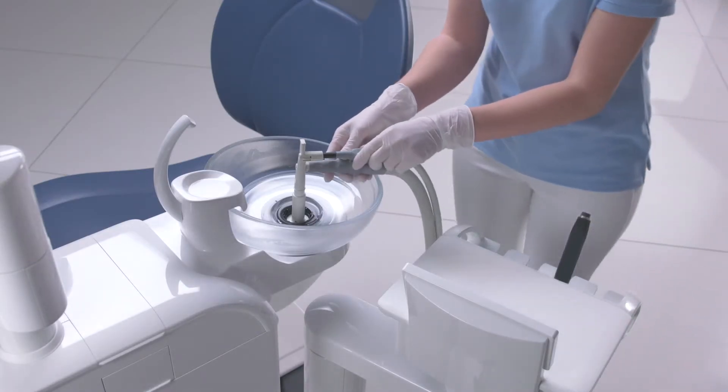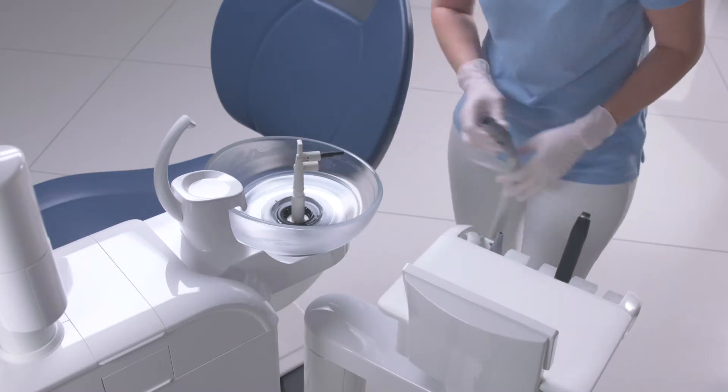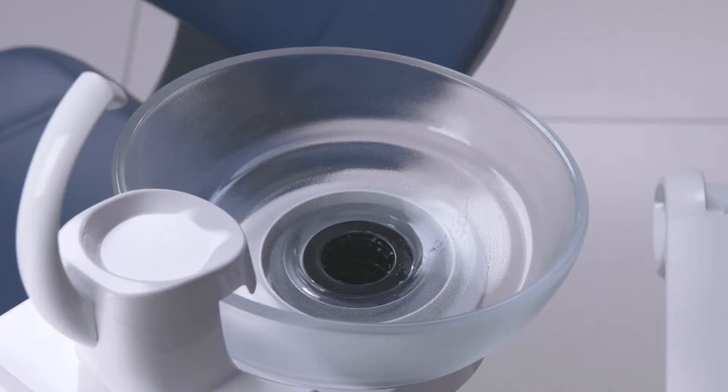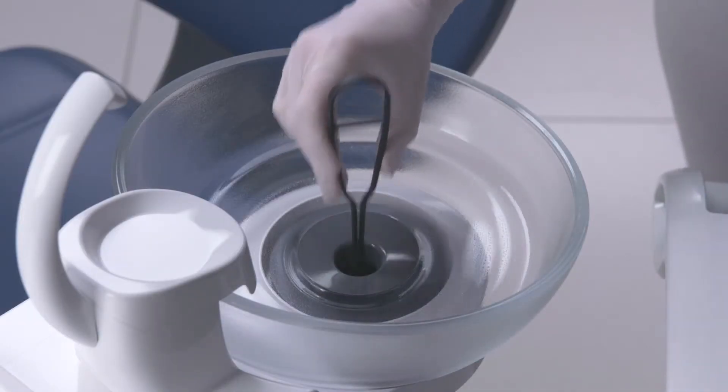After finishing the suction process, pull off the hoses and place them back in their position. Remove the cleaning adapter and reinsert the gold trap.